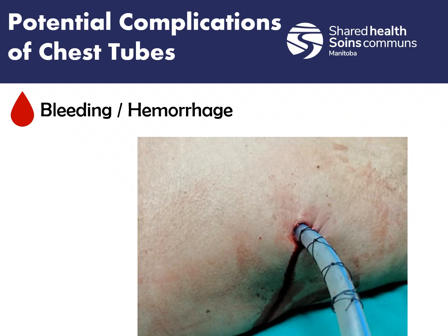See if there's any swelling around the site as well, because that's kind of a big deal. If there's any interior bleeding inside the chest wall, that could cause swelling or redness, so we want to make sure we're checking for that as well. Make sure the dressing's intact, so we've got that nice clean dressing on there, it's all secured properly, and it's not going to fall off. We want to check all of that before we go. If you do notice some new bleeding or it looks like it's leaking through the dressing, make sure to tell the sending facility before you take the patient on the transport. That'll need to be addressed before you go.